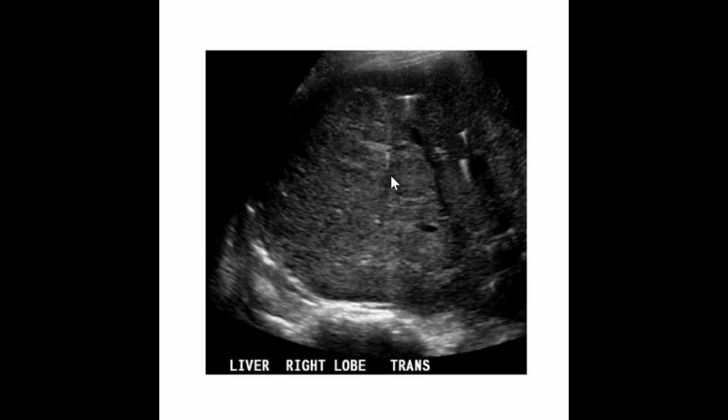Here's another example of air within the biliary tree of the liver. We have a little bright reflector here. This is where the air or the gas bubble is located, and then we have comet tail artifact just behind it. Again, that is because sound is interacting with that small space of the gas bubbles.